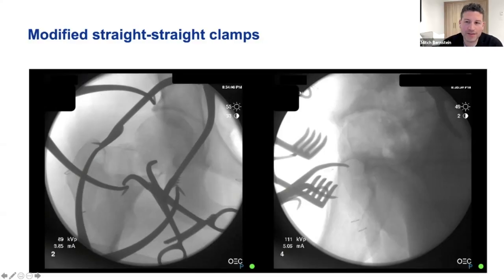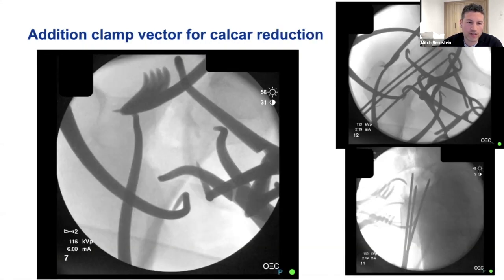So I use these clamps on all my femoral neck reductions. And again, you can see they're eccentrically located in the anterior femoral neck. They're put in through 2.5 millimeter drill holes, and they can help reduce that apex anterior deformity and obtain compression at the fracture margin. And I will seek out reductions, as John mentioned a lot, and ensure that there's actual anatomic cortical interdigitation.